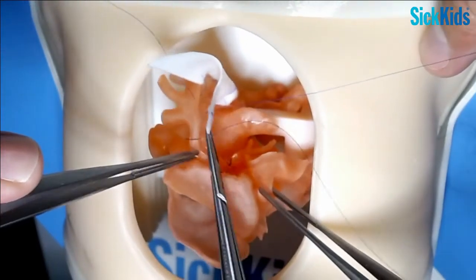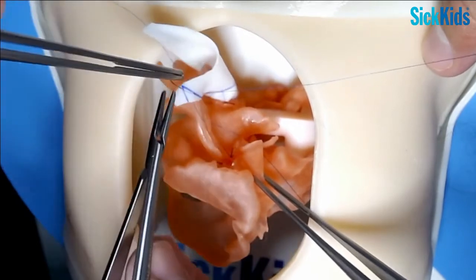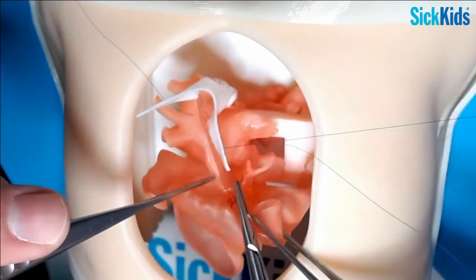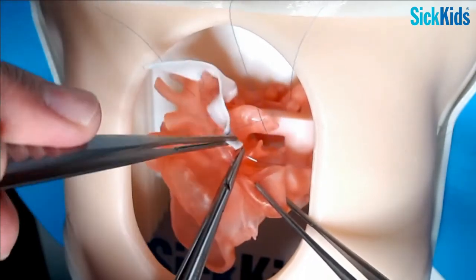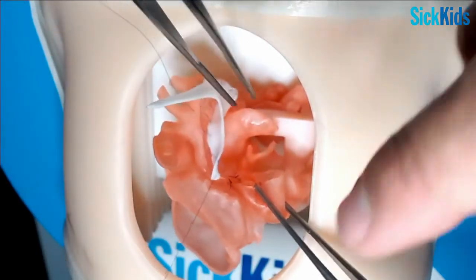Big, huge jumps. Oops. Bring that up to the corner here. Relax that a little so we don't stretch it. Good. And then let go of that.